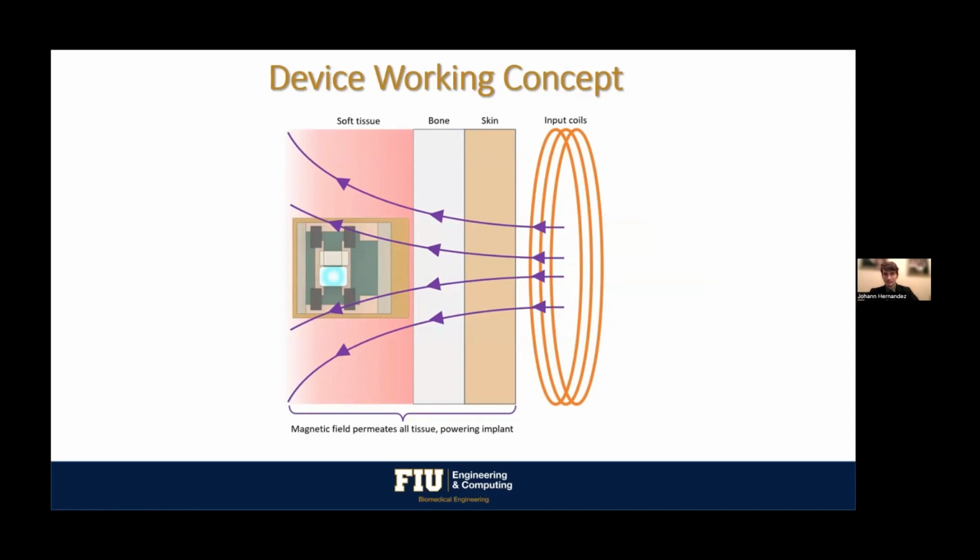So we'll apply requisite kilohertz level AC and DC field that will resonate with the magnetostrictive foil, and that will provide a mechanical load on the piezoelectric fiber, therefore providing an AC voltage that is then rectified by the rectifier circuit and fed to the LED, illuminating it and light adapting the photoreceptor cells of the eye.